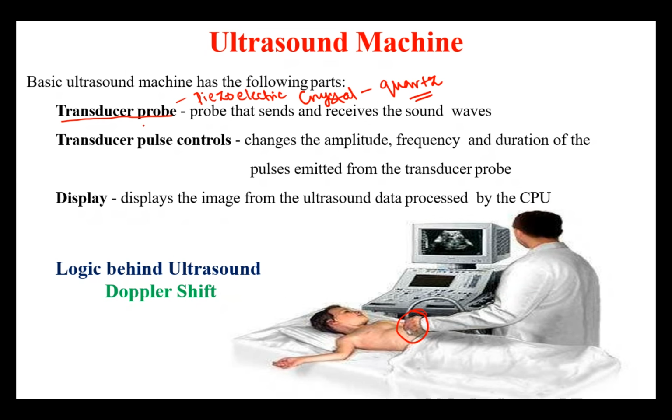The important function of the transducer is that it transmits signals and receives signals. It converts one form of energy into another form of energy. Piezoelectric crystal has a unique characteristic that can be used for both purposes, transmission and reception.